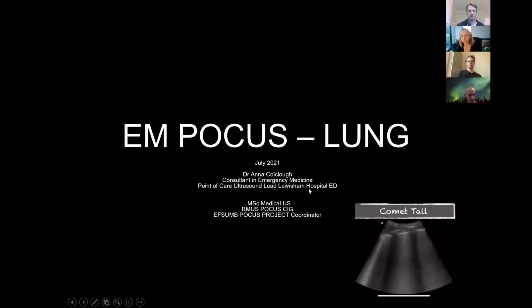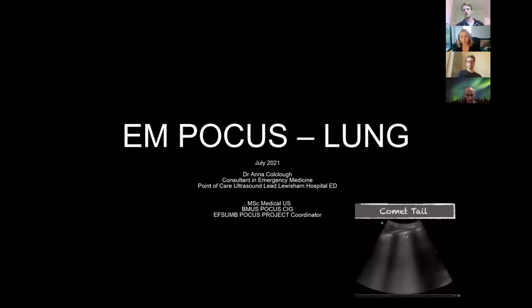Right, welcome everyone. So order of the day is lung ultrasound. We're really going to be talking about a bit of the quirky physics because I like it, and we'll touch on COVID ultrasound again because it seems to be a little bit more frequent in the last couple of weeks, and a few people have asked to go through it again.